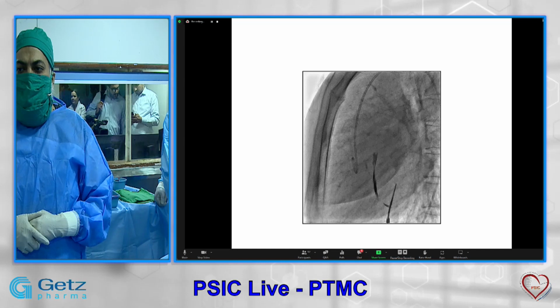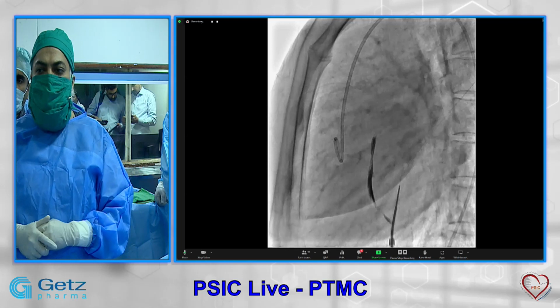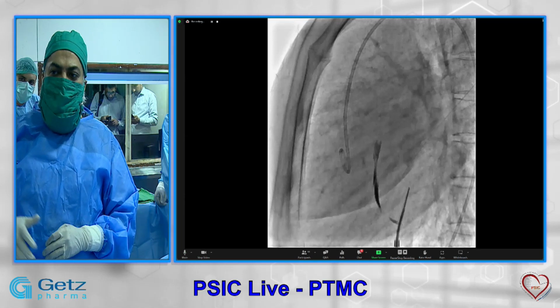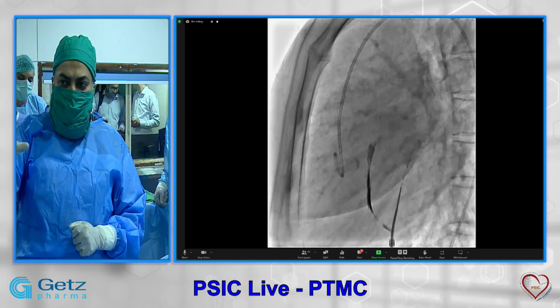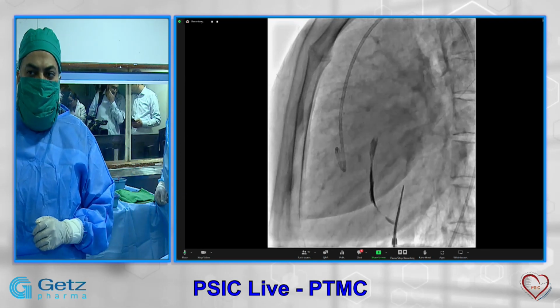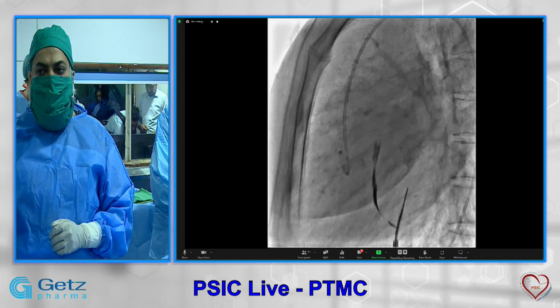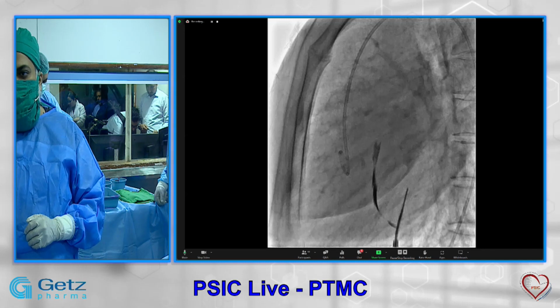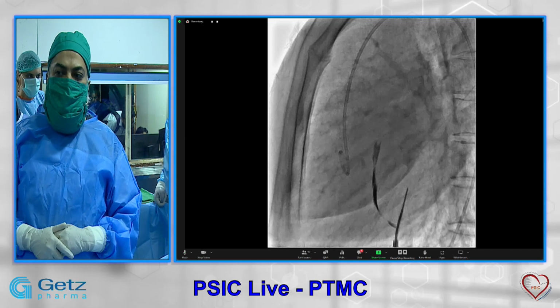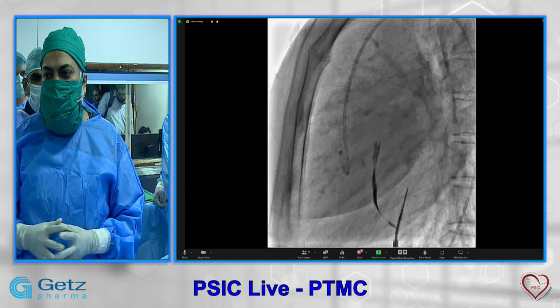Please run this one. This septum was stained during the procedure. We picked this picture so that we can understand how the septum and LA look in the lateral view. This septum has a vertical part and a horizontal part. If your needle is in the vertical part, you may dissect it. That's what happened in this case. We probably punctured into the vertical part, gave the dye, dissected, then took it out, reintroduced from the bottom, and went through the horizontal part. This is what we need to understand before we go for the septal puncture.